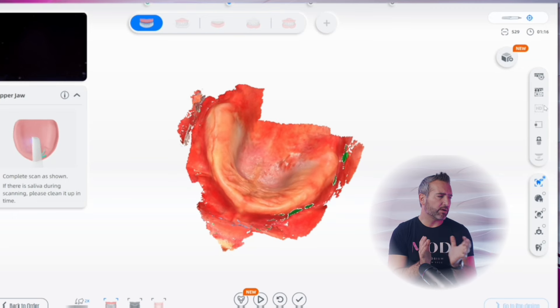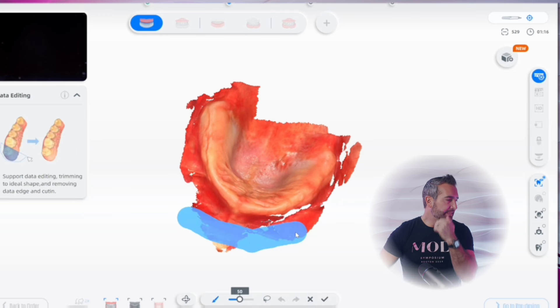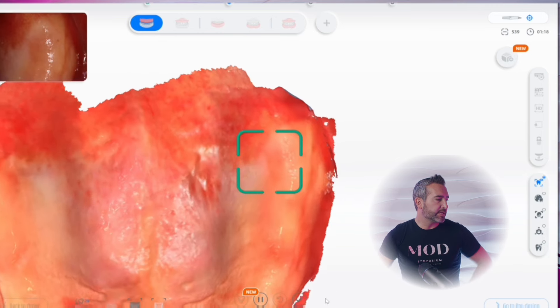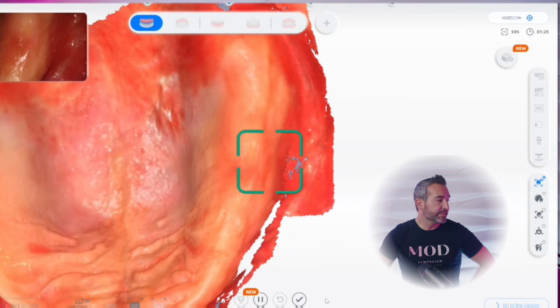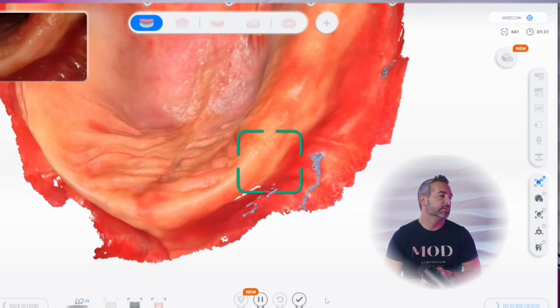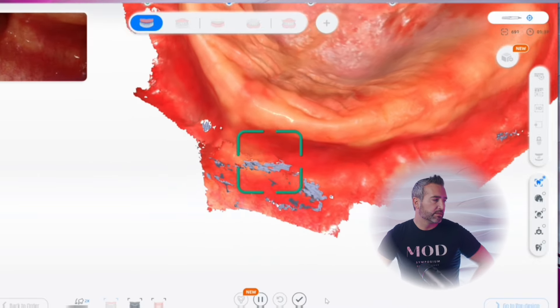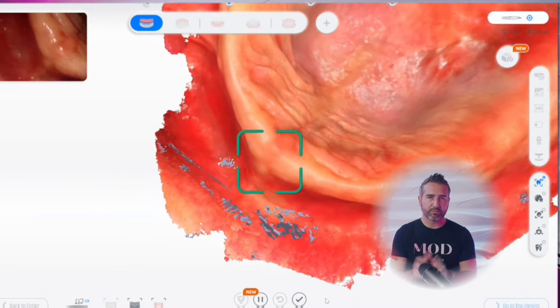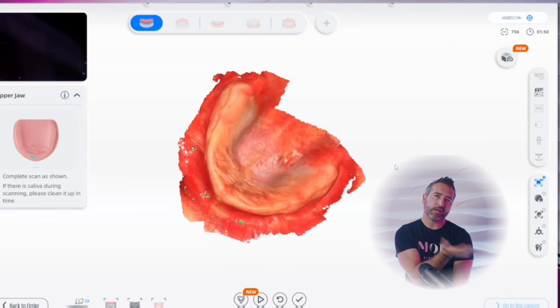I find it hard to do both sides at the same time so I always split the maxillary arch into sections. You can see me using the eraser tool on one side, then going back to capture the hamular notch and borders. It does a really good job just picking up and filling in those areas — that's probably all I need, and it's a true mucostatic impression everywhere you're not pushing or compressing flabby or edentulous ridges. Really nice scan there.